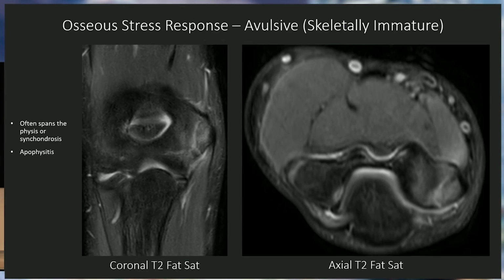The reason is there are variations of normal that can appear pathologic, and oftentimes, especially as a musculoskeletal radiologist, we get these cases as second opinions where the finding that was called doesn't really fit the patient. As long as we have some awareness that variations exist that can appear pathologic, at least we can add that to our differential. A couple examples: the way the physis closes is not always symmetric. We see that in the ankle, something called Kump's bump, where there's asymmetric closure on one side of the physis compared to the other, and sometimes that gets confused with a physeal injury.